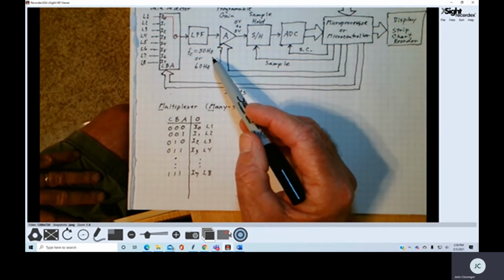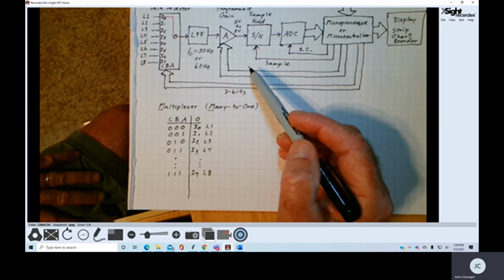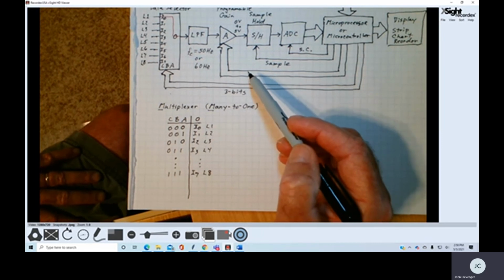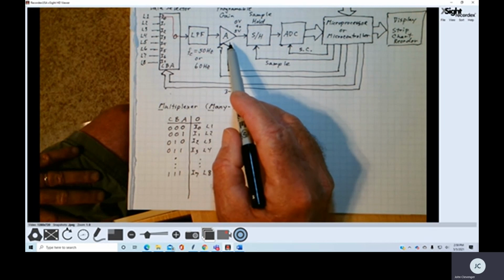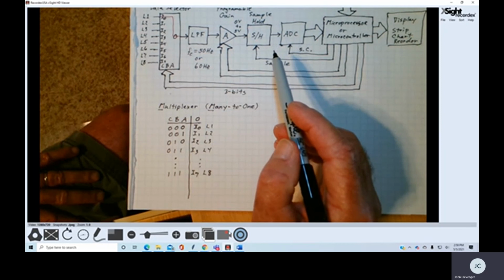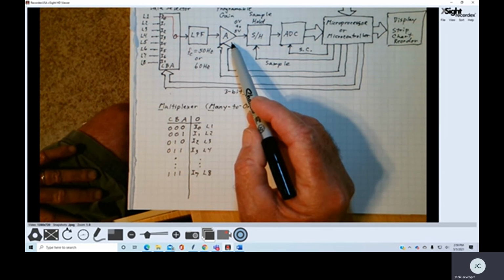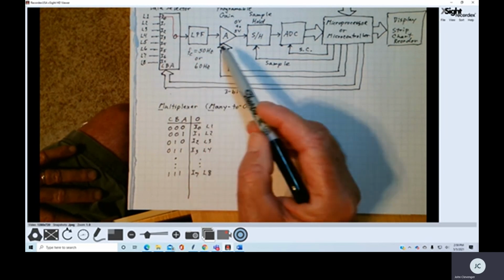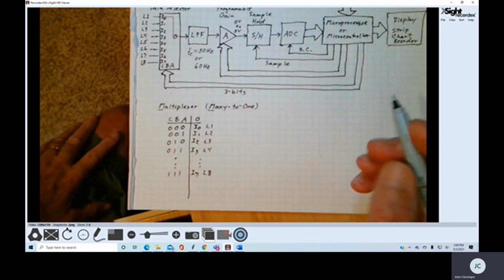I guess it's a question of where we want to limit the gamma wave information, or if we do want to limit it, or how much we want to limit it. So then we look at the programmable gain amplifier, and again we talked about amplifiers in the presentation. The purpose of this is to amplify the input signal, but also to reject any common noise signal, any noise that's present coming in from the leads and managing to get through the filter block.